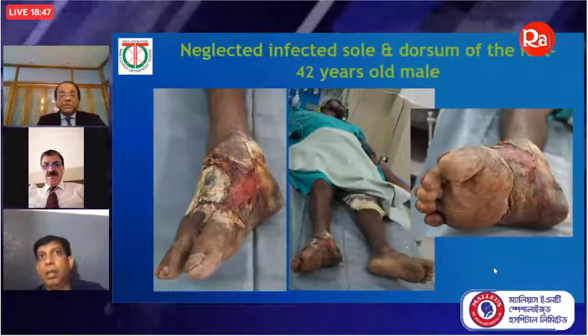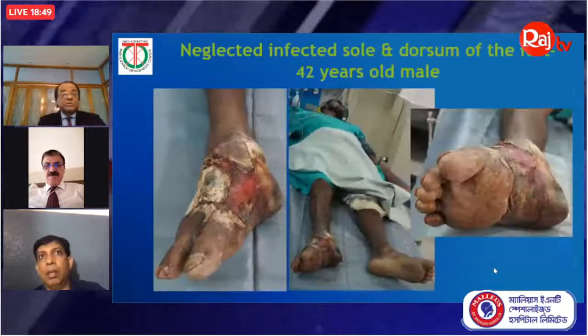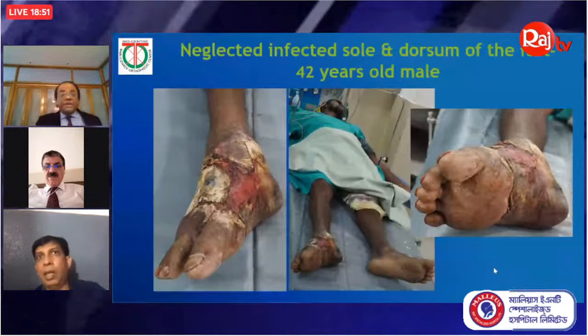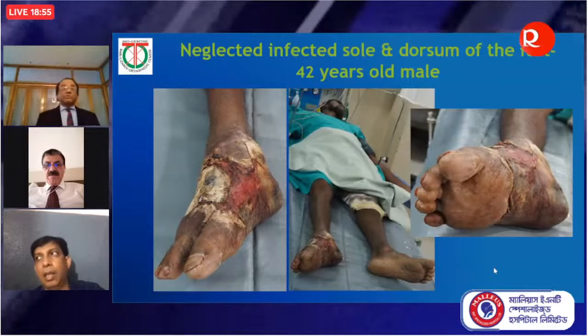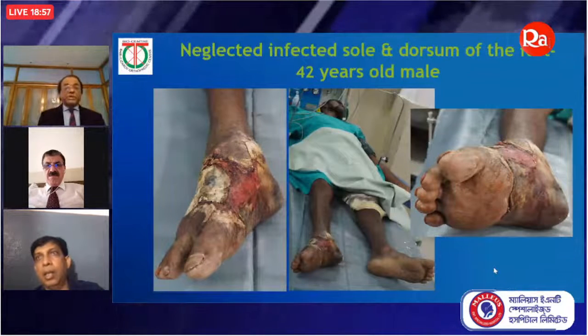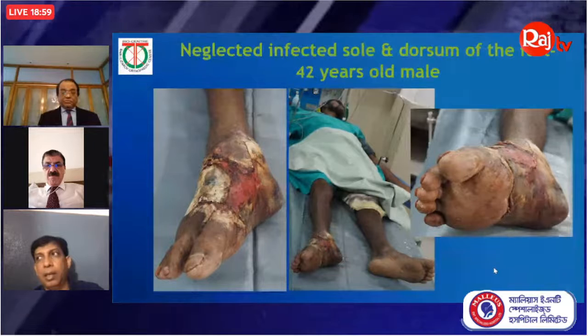Now, dear friends, again you see here a neglected intractable wound on the sole and dorsum of the foot of a 42-year-old male. See, look at this skin condition.